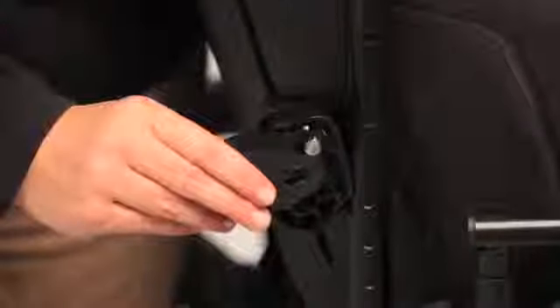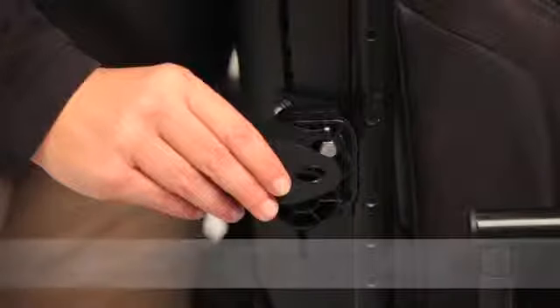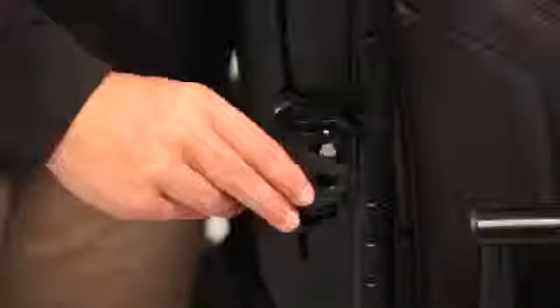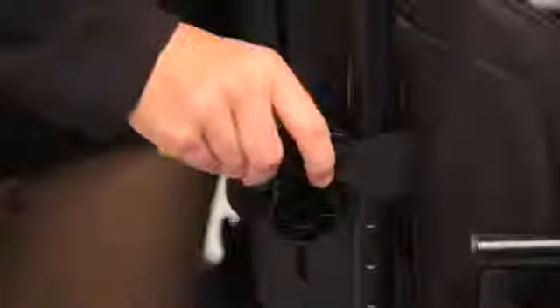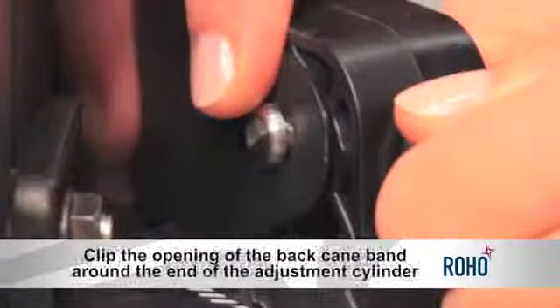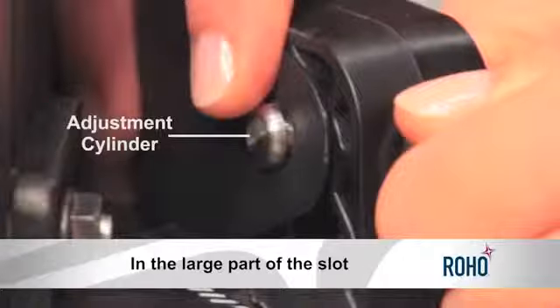Once both back cane bands are flipped open, align the brackets with the wheelchair. Make sure the hardware is flush against the wheelchair back canes. Now you're ready to attach. Wrap each back cane band around each of the wheelchair back canes. Using your thumb, push against the bolt and clip the opening of the back cane band around the end of the adjustment cylinder in the large part of the slot.